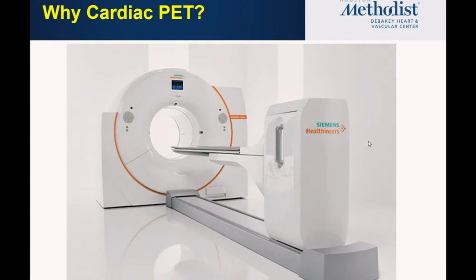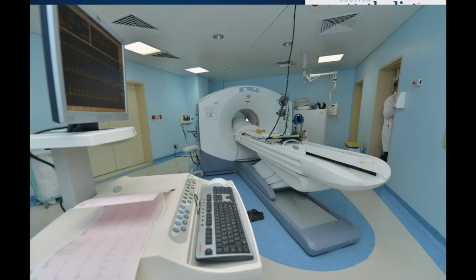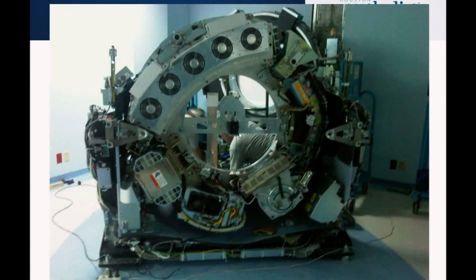In contrast, this is how a PET CT machine looks, and this is the Siemens Vision that we have in our lab here. In the front is the CT part, and the back is the PET part. I'm going to show you another one from a different vendor. This is from GE, a GE Discovery 690 that I worked with for some time. If you open up these nice coverings, this is how the machine looks from inside. If you are in a place where they are installing a PET CT, this is how the machine is brought in on site.